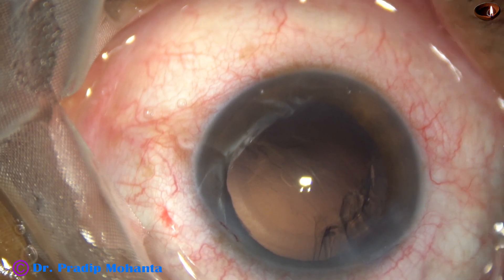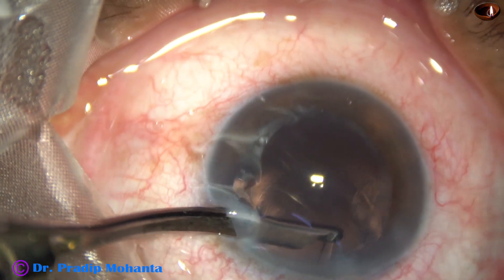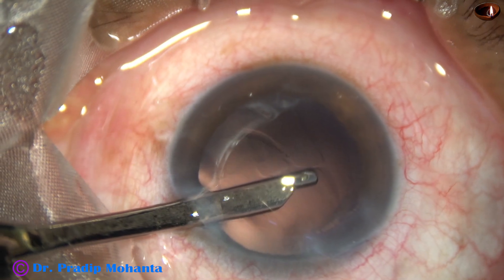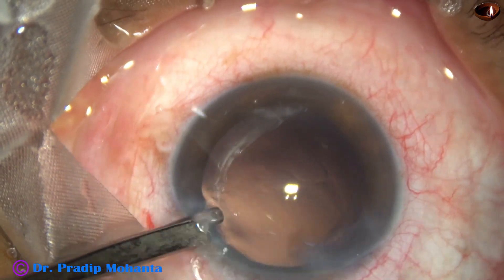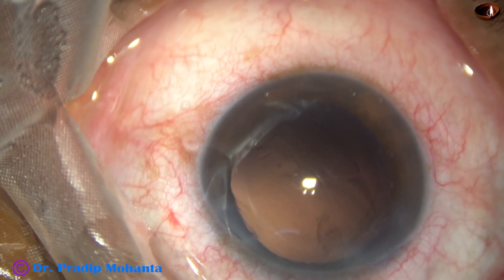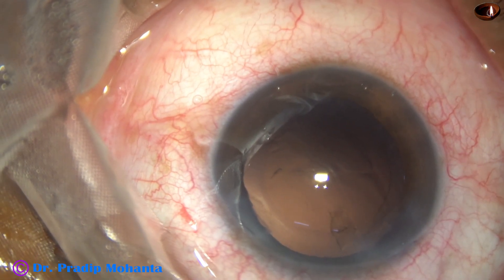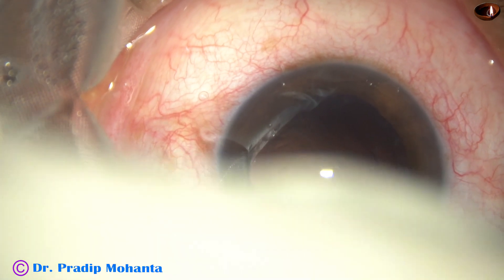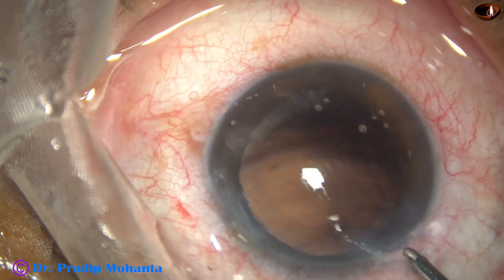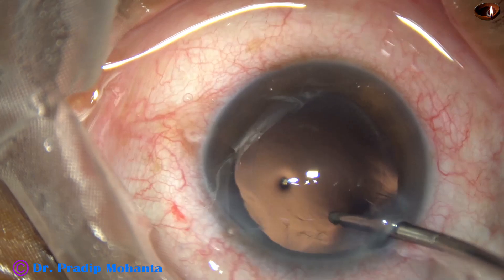I go through the side port — you can hold the cannula with the left hand and aspirate with the right hand, and it is done. A little bit of cortex is just in front of the main wound and it will come out later while we polish the posterior capsule by irrigation.